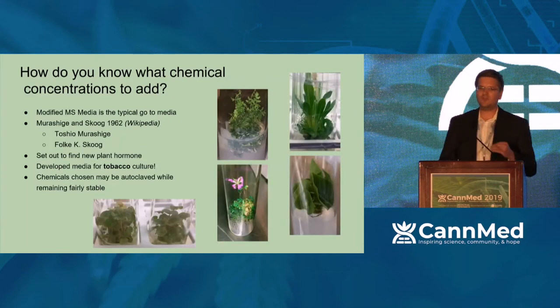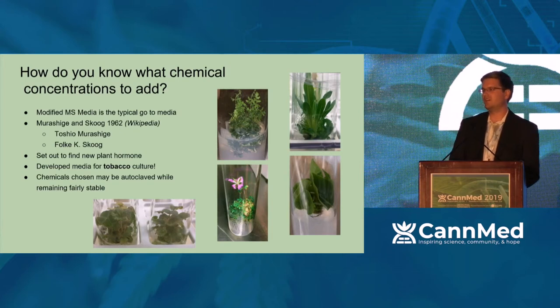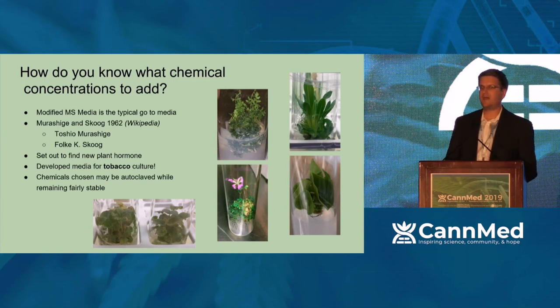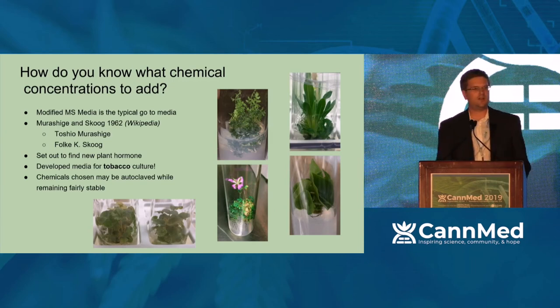So how do you know what chemical concentrations of all these things to add? Well, apart from lots of different nutrient companies that have developed this stuff, there is a media called MS Media. It is the standard for pretty much every tissue culture protocol that I've seen. There's a couple modifications for bananas or orchids or things like that. But in general, this MS Media was developed for tobacco culture. And that is key to talk about here, because cannabis is not tobacco.